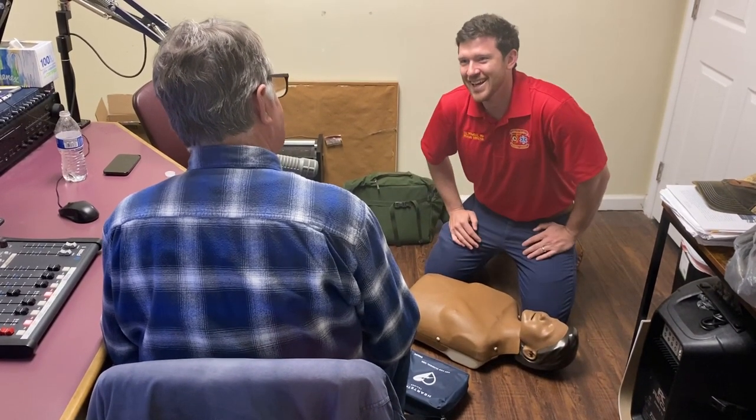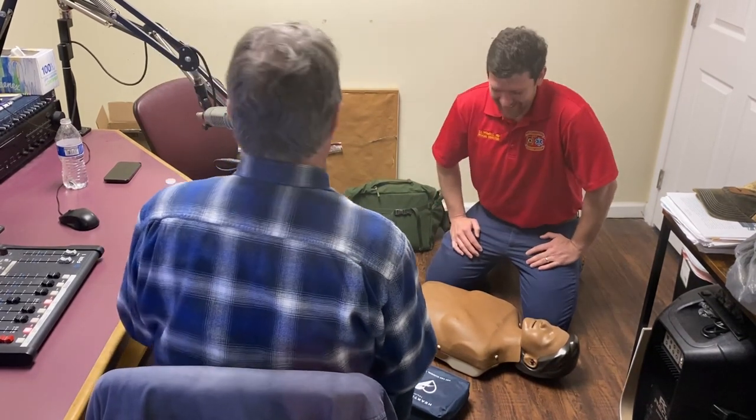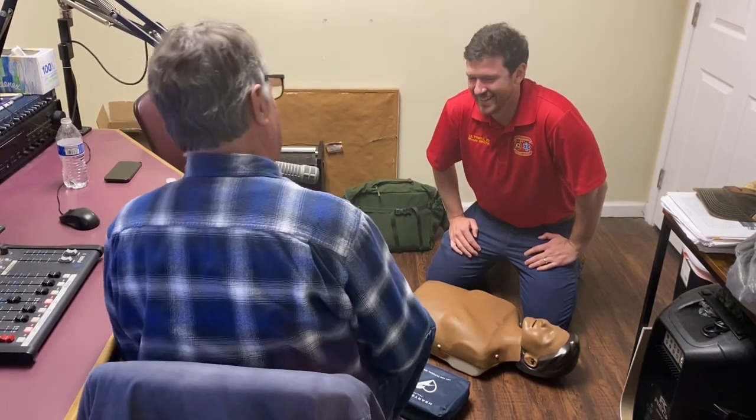Staying alive — staying alive. The tempo of that song is the right rate for compressions. We understand you can't use that in the training, but yes, it's the right tempo reference.